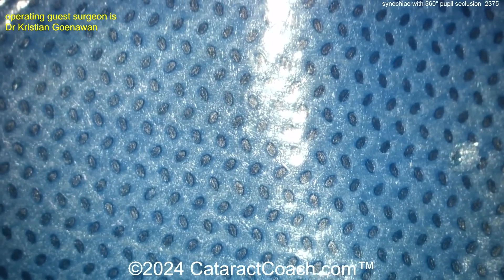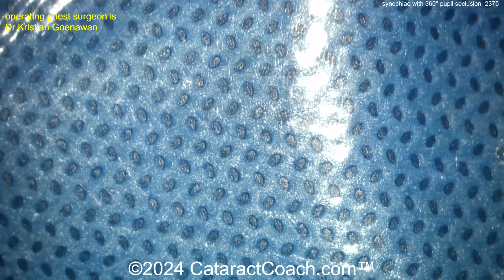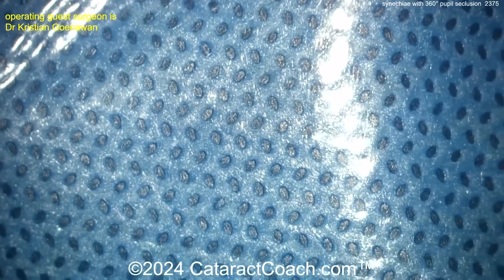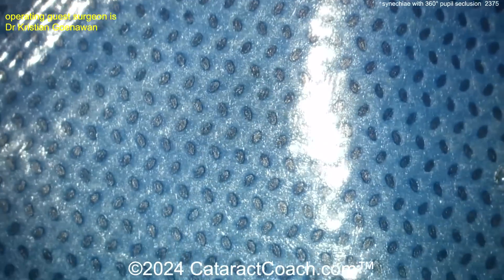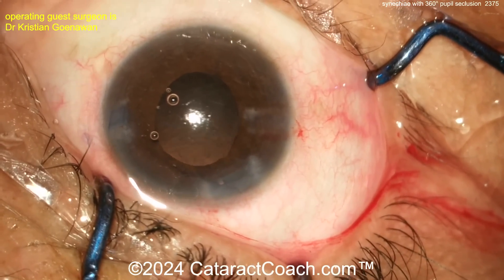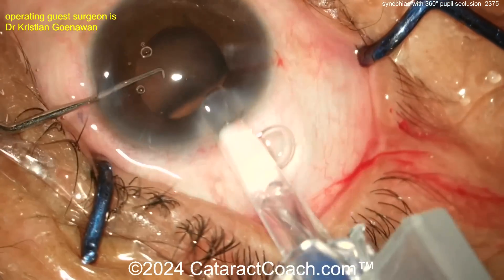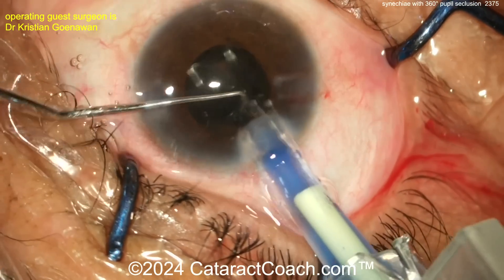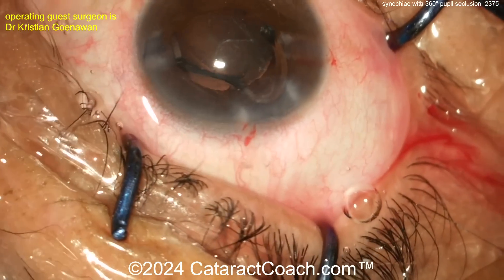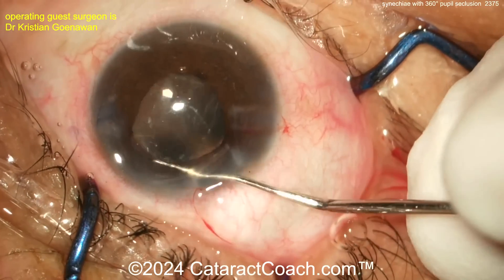The scope is moved away from the drapes — this is probably to avoid light toxicity to the retina as a new lens is being loaded. I could cut this section out but no — we all need to feel what the surgeon is feeling. Skipping ahead five minutes — that was the surgeon's edit, not mine. Now let's see if the lens goes in again. Hopefully it's loaded appropriately this time. It looks better — but it's still kind of stuck. I would have this technician review lens loading, as that may be a recurring issue.